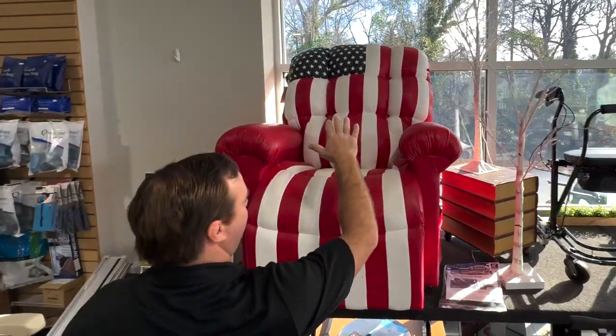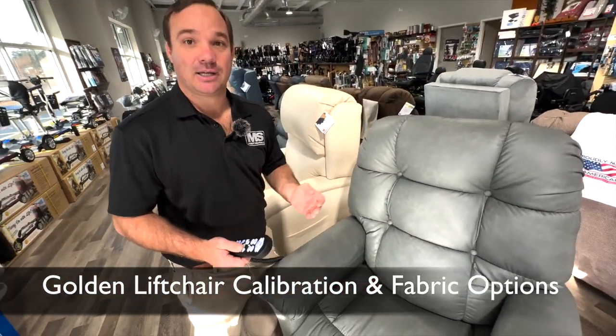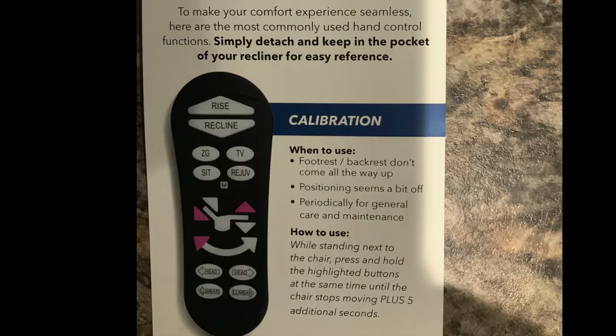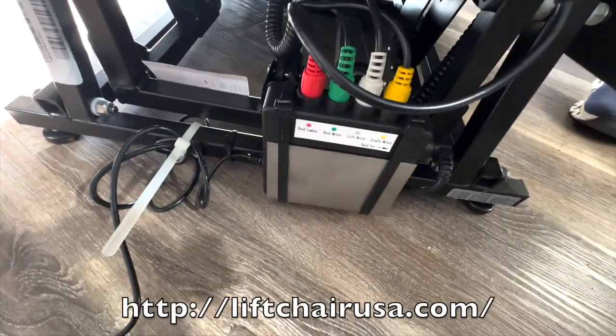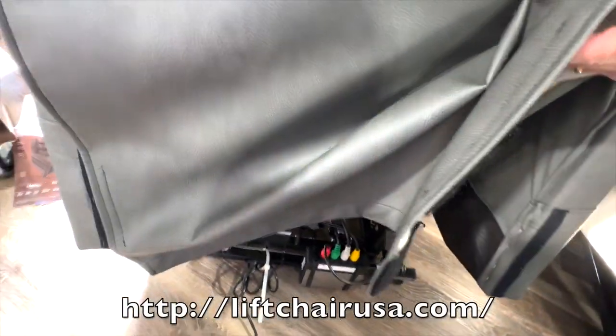These are USA-made chairs but they tend to get out of sync because there's a control board. If you're pressing a lot of buttons you can lock it out, so you need to resync or recalibrate it, just like you would your computer. The control board is the only way to make all these features work — power pillow, lumbar, all these motors — and it's right down here. Sometimes it gets a little out of sync and you have to recalibrate it.